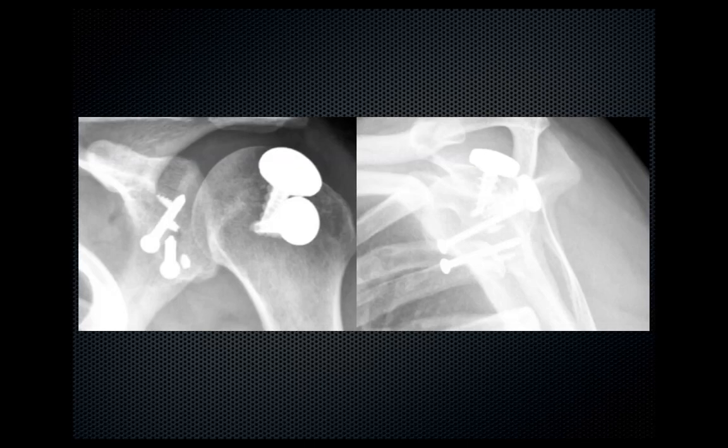This is the post-operative X-ray, which shows a 25 and a 20mm HemiCAP inserted into the defect, as well as a Latarjet procedure. Previously, we were repairing the capsule between the glenoid and the Latarjet with metal anchors, as we can see here.